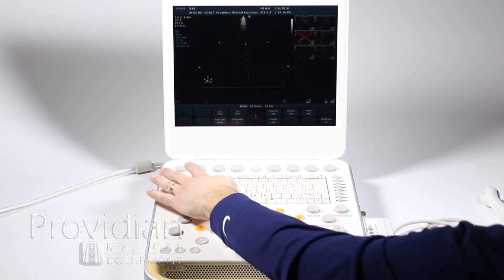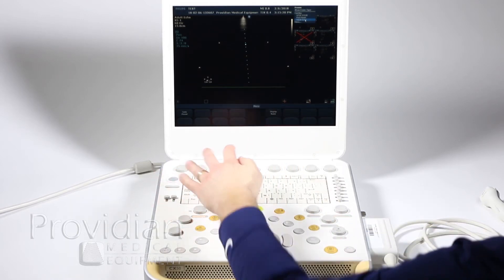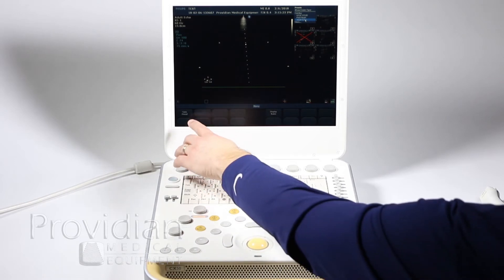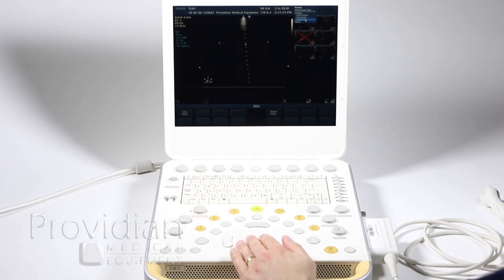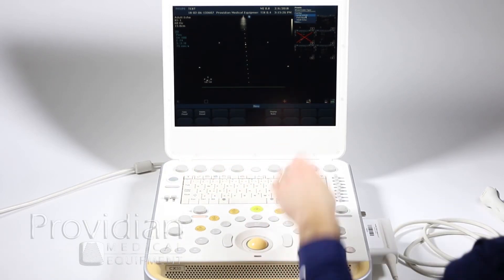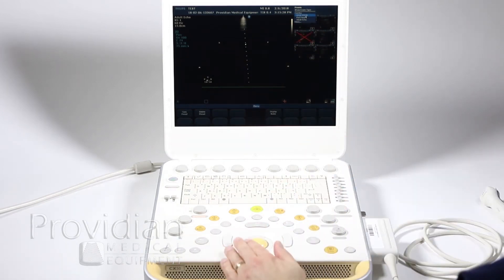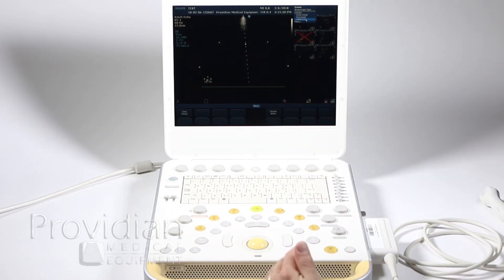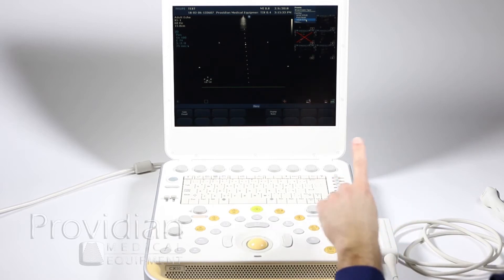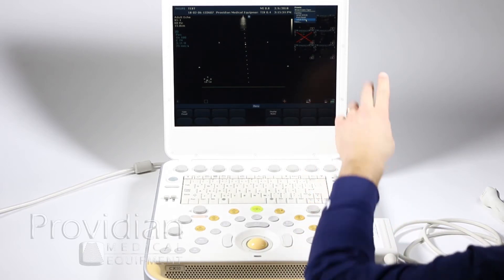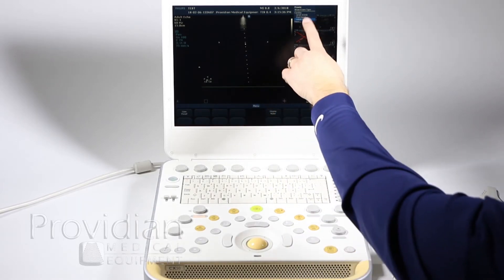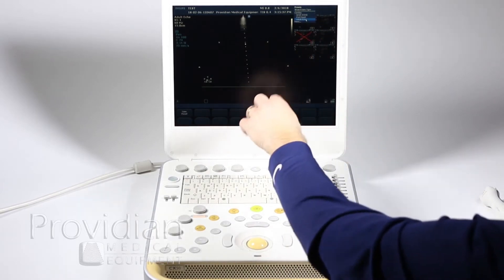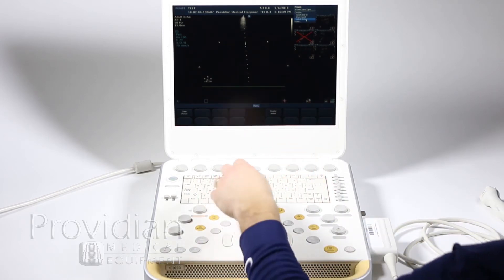You're going to do the same thing you did to select a preset. Hit the preset button and over here it will say save preset. So first you want to take this trackball and highlight the preset that you want to create, based on whichever one. This isn't going to change the current one. Let's say I'm basing it on this adult echo and the changes I just made.